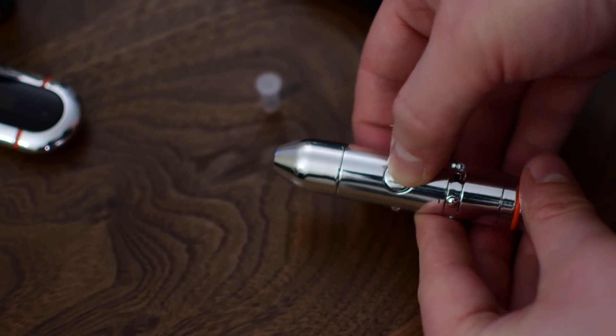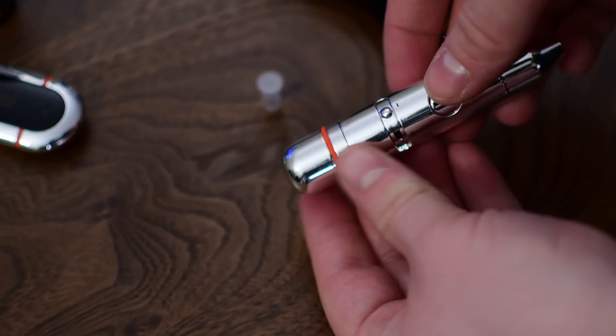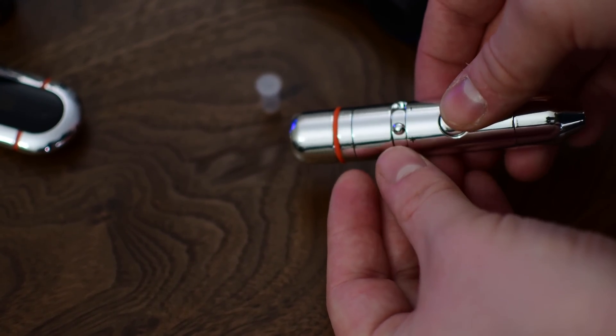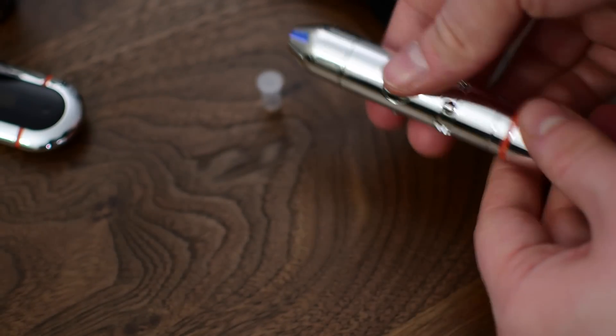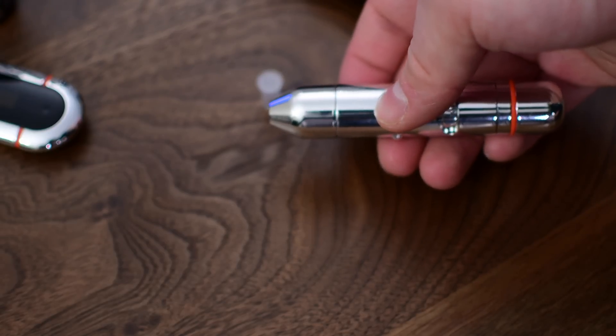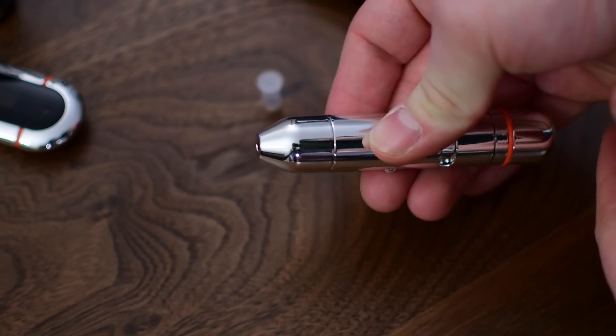There are pretty standard tips that you can put into the lancer. Put it in, make sure it's all the way in, put the cap back on, and it's pretty much like many others. You pull back the back of the actual device and then click the little button and it'll prick your finger. There is an adjustment here, so you can have it go deeper or more shallow, depending on how calloused your hands are. I just keep it on the shallowest option and it does just fine.